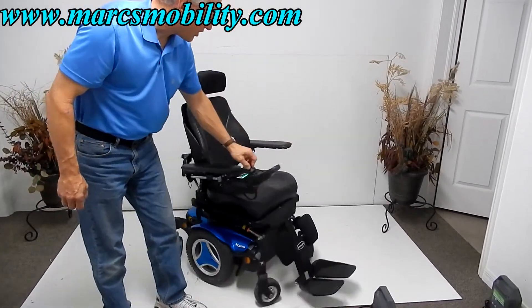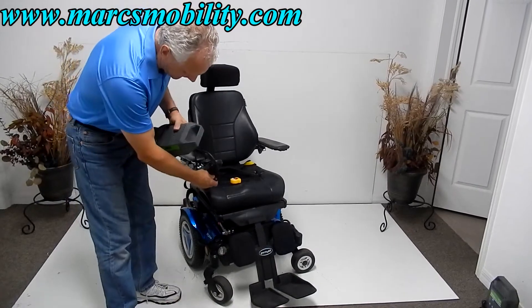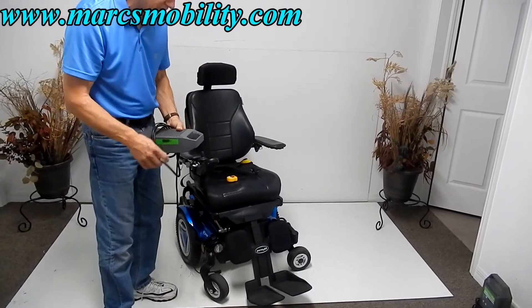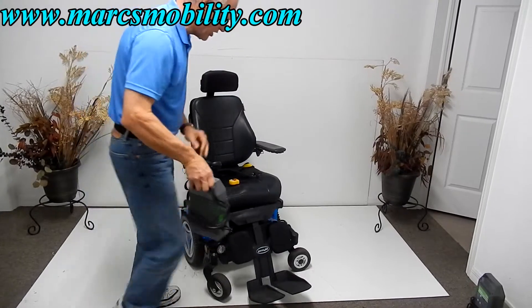Also, if you need to charge the chair, you would take your charger and plug it in at the bottom of the joystick. Once the light turns green on your charger, you're fully charged. Once the chair is full, the charger will recognize it and stop charging, so you don't have to worry about overcharging your chair.